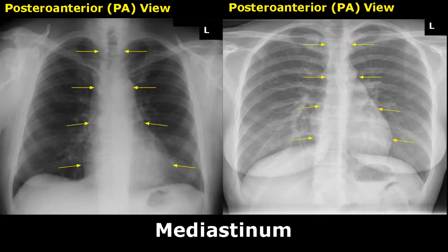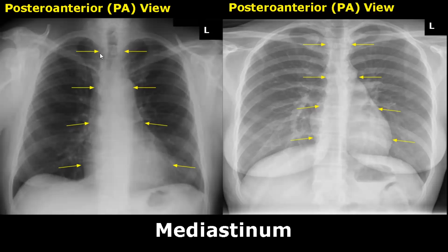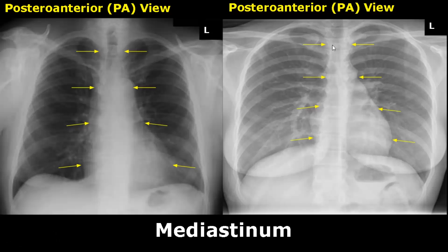The mediastinum is the space between the lungs in the midline of the chest. The trachea, esophagus, thymus, heart, major blood vessels, phrenic and cardiac nerves, lymph vessels, and lymph nodes are all part of the mediastinum.